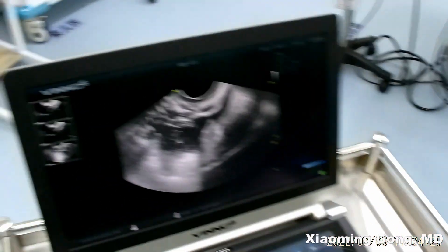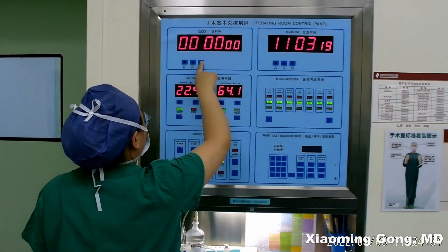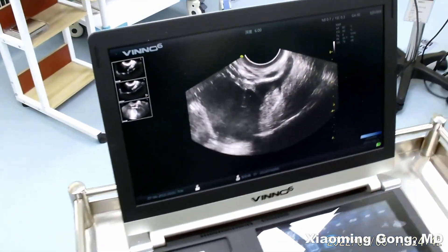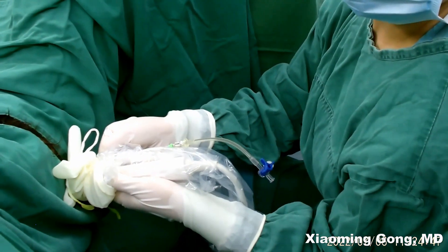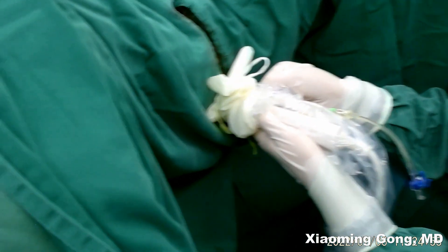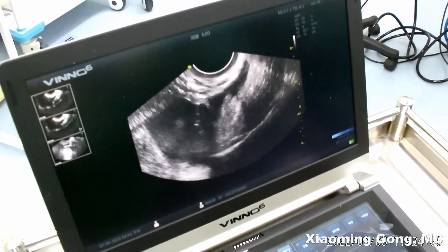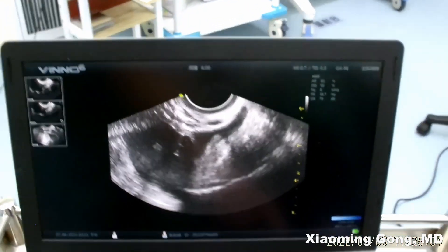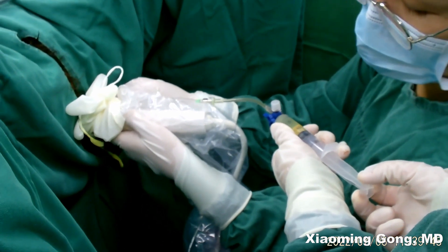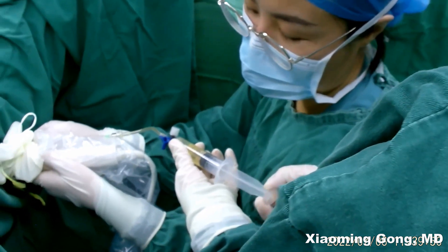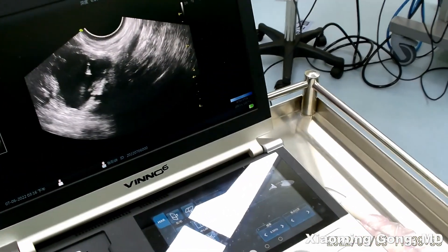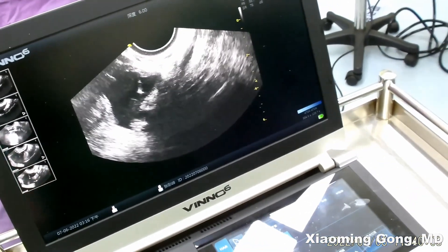This patient has a cyst volume of 35 milliliters, so we inject over half of that volume — 25 cc of alcohol — inside the cyst for the sclerotherapy. After 15 minutes, we will remove the alcohol. During this time, the alcohol will treat the cyst wall. Usually we will leave several cc of the alcohol inside the cyst to achieve a better result after sclerotherapy.